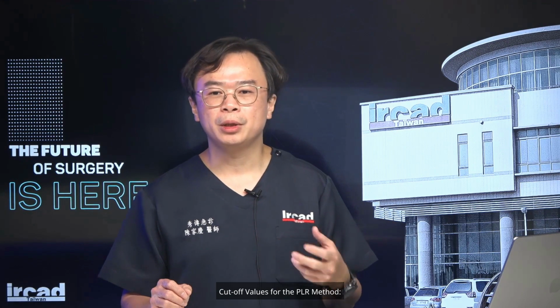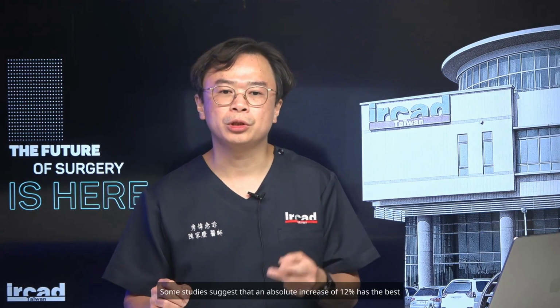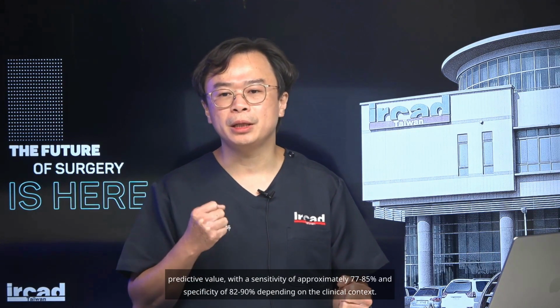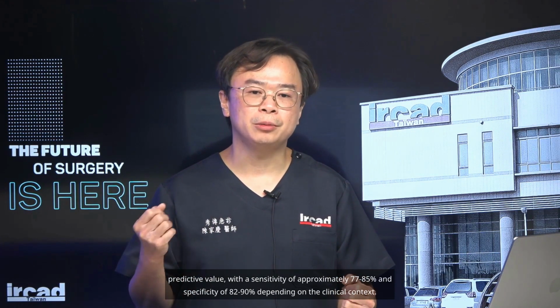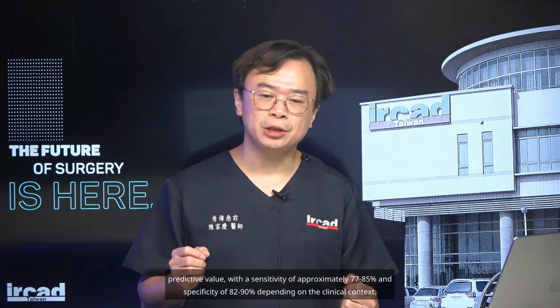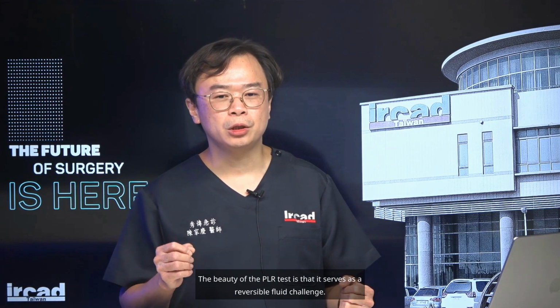Cutoff values for the PLR method. An increase in LVOT VTI of 10–12% following PLR strongly suggests fluid responsiveness. Some studies suggest that an absolute increase of 12% has the best predictive value, with a sensitivity of approximately 77-85% and specificity of 82-90%, depending on the clinical context.